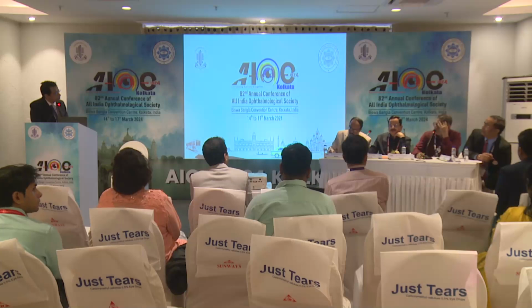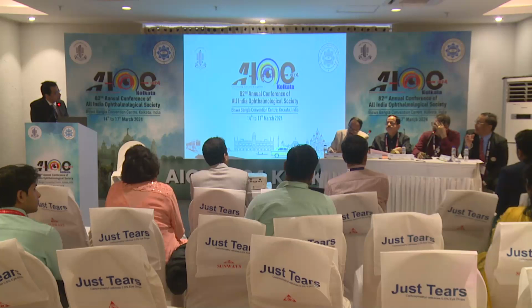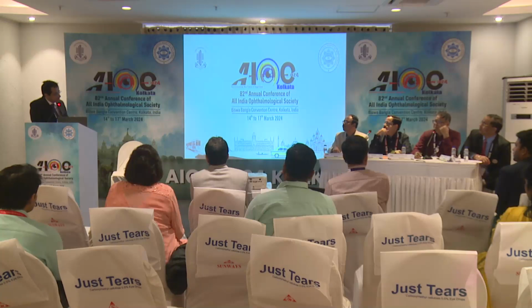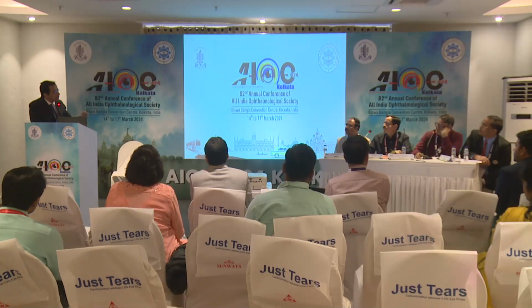So you have said you were doing a tap, and you said anterior vitrectomy would be disastrous. What about limited posterior vitrectomy? No, I think anything entering into the eye now, yes, sir. No, core vitrectomy is going to be much more disastrous because that will be uncontrolled. Even a tap is a little bit permissible because it is just valvular and just closes on it. Because basically you want to close the eye as is. When you open and evacuate and start creating hypotony, the choroidal vessels rupture, and what could have been a limited suprachoroidal hemorrhage just expands.